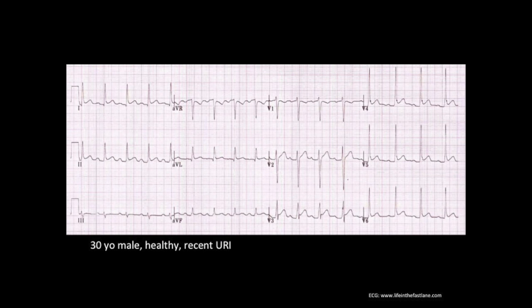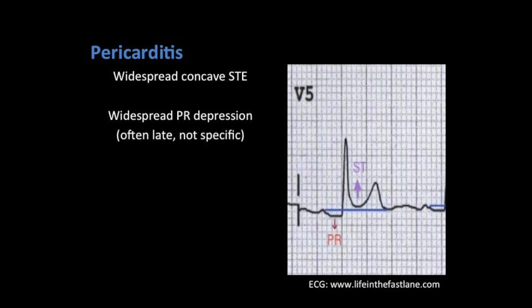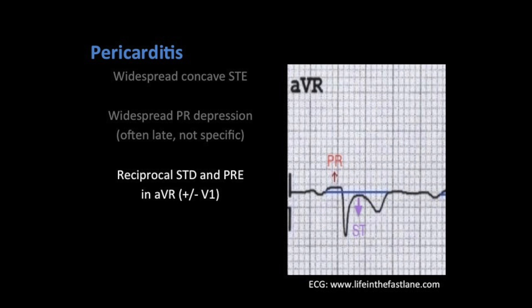Here's our next ECG. This is a 30-year-old male, healthy, with a recent URI — upper respiratory infection. This is kind of your classic patient for pericarditis. Some of the ECG signs of pericarditis include widespread concave ST elevation as well as widespread PR depression. This depression can often be late and it's not very specific for pericarditis, but it's something to look for. Since AVR and V1 connect a little differently sometimes, these changes seen with pericarditis will be opposite or reciprocal in these leads, so we get ST depression and PR elevation.